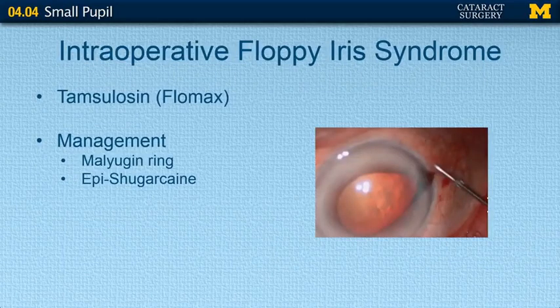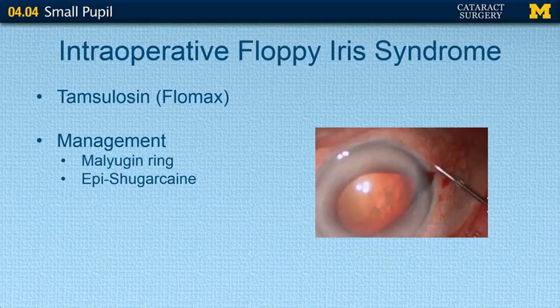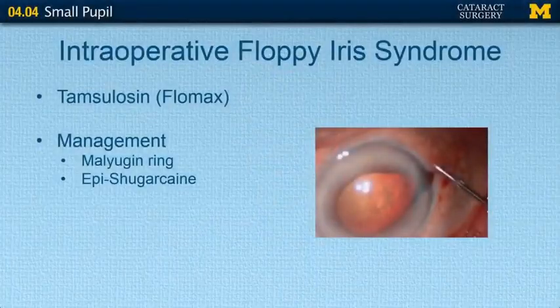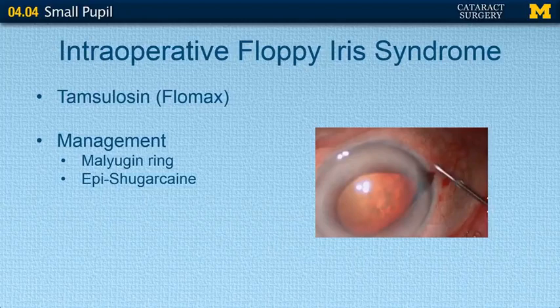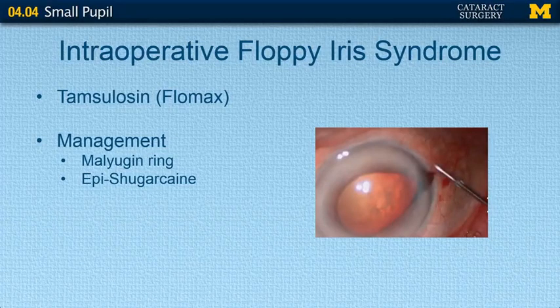Intraoperative floppy iris syndrome, also known as IFIS, is typically associated with tamsulosin, also known as Flomax, a very common medication used for prostate issues. This alpha-1 antagonist leads to small pupil issues developing during surgery — typically during phacoemulsification, where the pupil suddenly shrinks and the floppy iris prolapses toward the wound. Typical management includes the Malyugin ring or the use of epi-Shugarcaine, which is a combination of preservative-free epinephrine, lidocaine, and BSS, providing both pupil dilation maintenance and anesthesia.